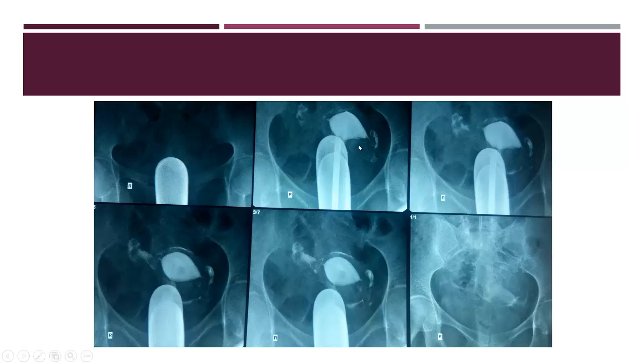Okay, here is this abnormal shape again of the uterine cavity. Note here the contrast is delineating the myometrium. This is a normal finding. Sometimes when the spill occurs, the myometrium becomes delineated from outside. So this is a normal finding.